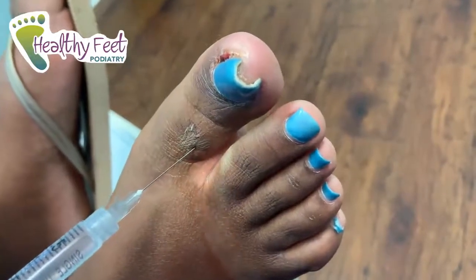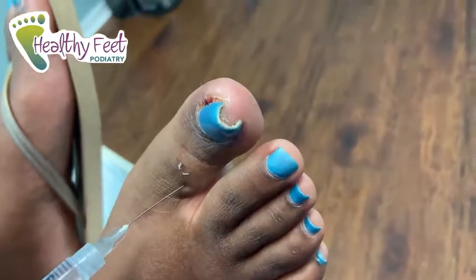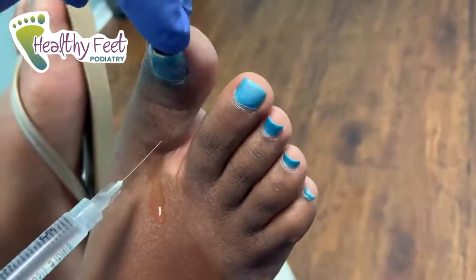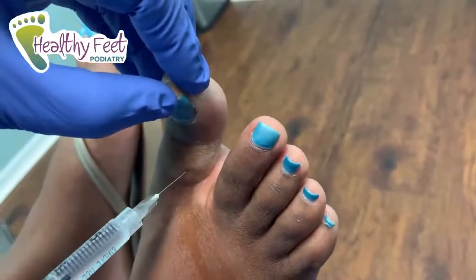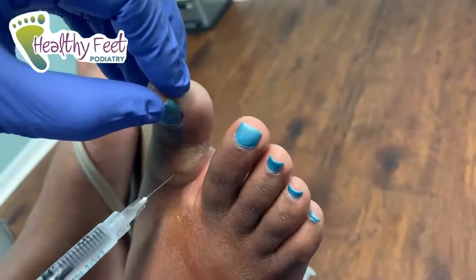Okay, so injection goes in. We'll raise a wheel. A little burn, right? You kind of see the area get a little fat and then gorged with medicine. Okay. And again. We'll slowly advance the needle and drop a little bit of medicine at the base of the toe as well. So plantarly.